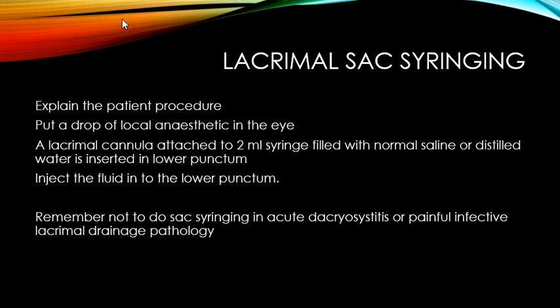Remember not to do the sac syringing in a patient who has got acute painful swelling in the lacrimal sac area or any acute dacryocystitis. Generally try to avoid doing a sac syringing in an eye which is acutely inflamed due to any infective pathology.